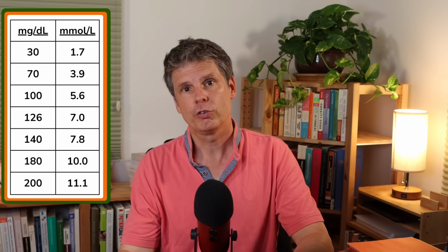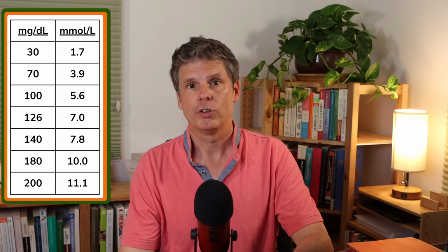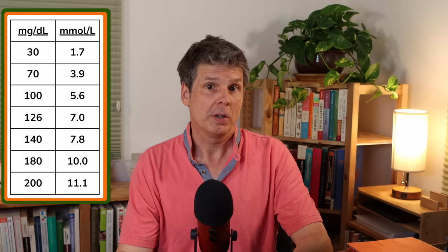A CGM can be a great tool to detect if you frequently suffer from hypoglycemia. If you observe your glucose levels dropping below 70 milligrams per deciliter regularly, I suggest you discuss this with a doctor. Hypoglycemia can be dangerous, and if you experience this regularly, you should not take it lightly.